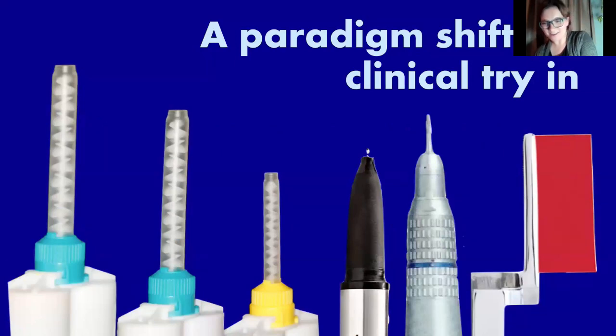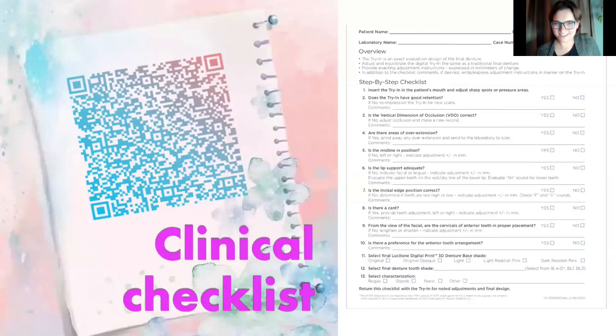So we're going to pretend like we always do try-ins. In this case, it's a paradigm shift for us clinicians that are very used to working with wax. So my armamentarium no longer involves a Bunsen burner and a number 7 wax spatula, but now I'm bringing in Sharpies, and I get to use e-cutters, which I really love using, my Dremel and grinding with a big fat pineapple burr. So at least I get to still do that.